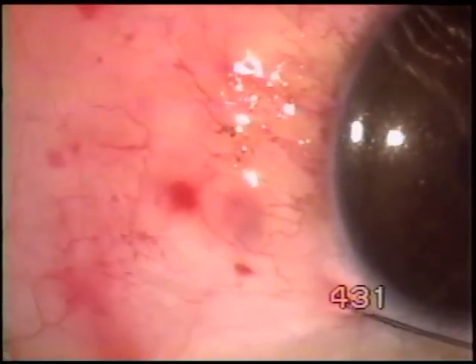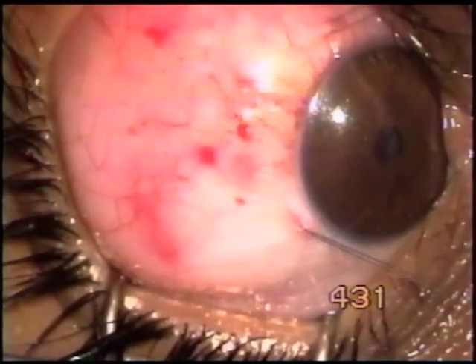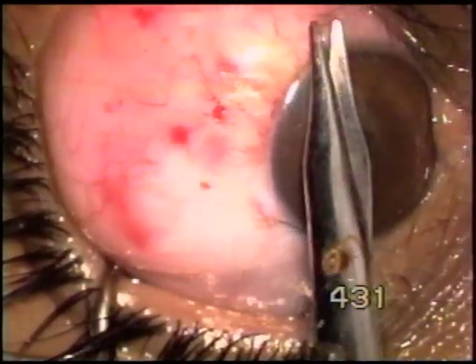And for the time being, this much surgery seems enough. Fixation sutures are being placed.